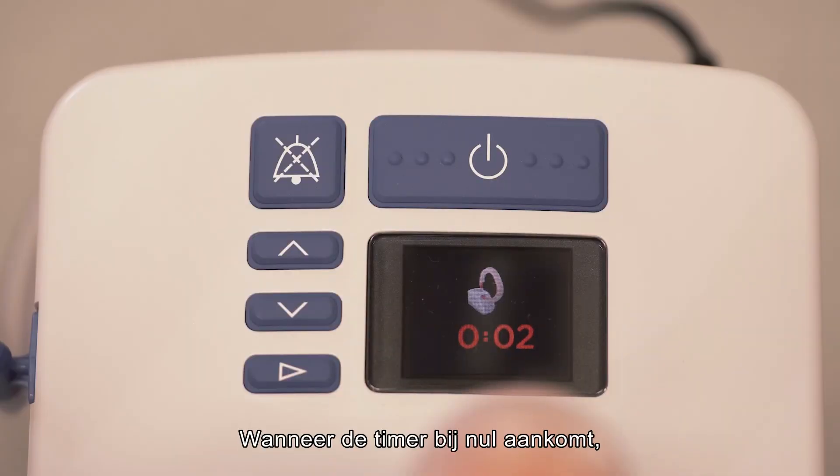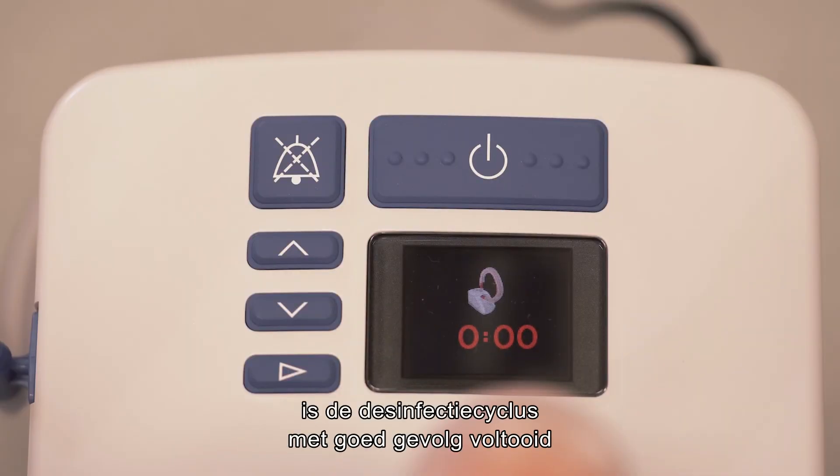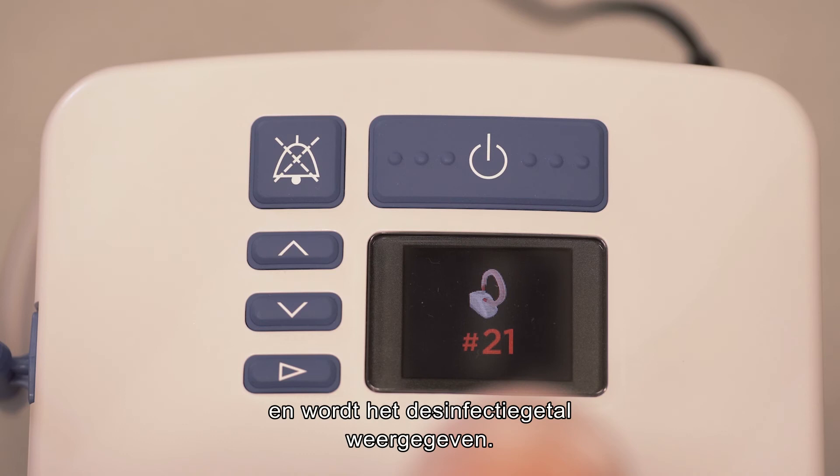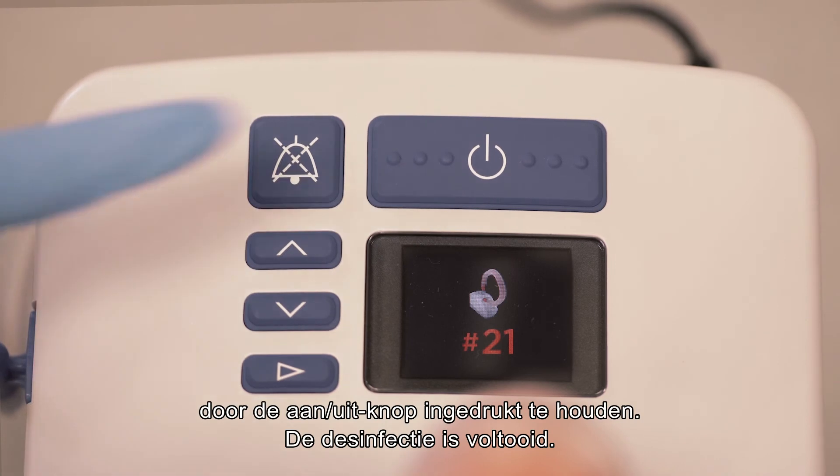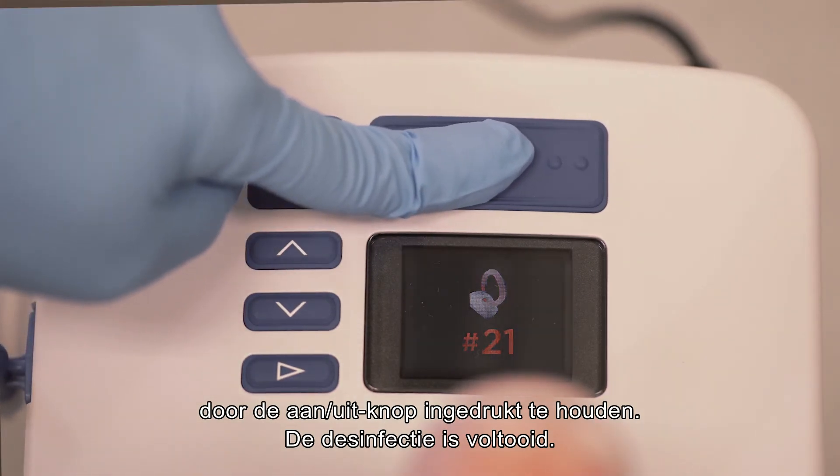Once the countdown reaches zero, the disinfection cycle has completed successfully and the disinfection number is displayed. Finally, turn the Evo2 off by holding down the power button. Disinfection is complete.